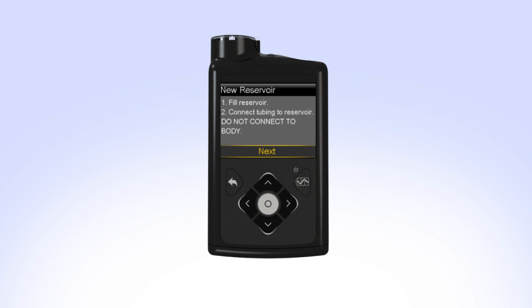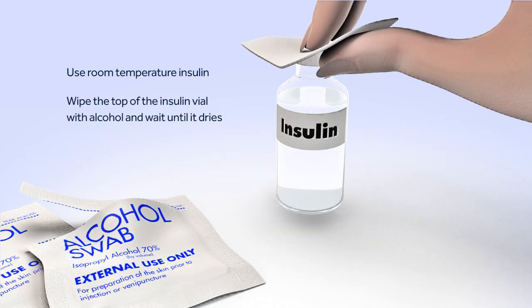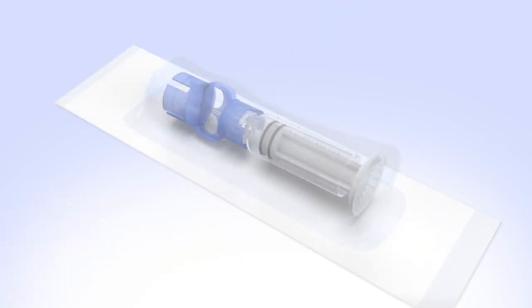You can now set the pump down and prepare to fill the reservoir. Before you can begin filling the reservoir, you will need to clean the top of the insulin vial. To reduce the risk of air bubbles, make sure the insulin vial is at room temperature. When you're ready, wipe the top of the insulin vial with alcohol and wait until it dries. Remove the new reservoir from the package.